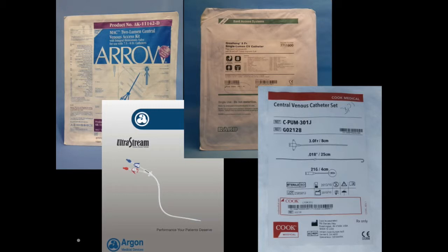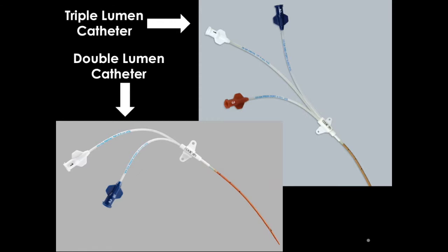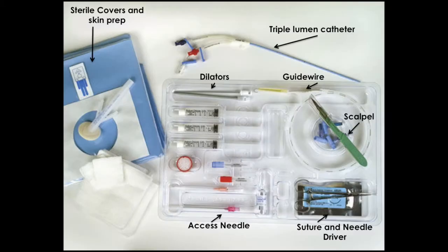There's special equipment you use to put in femoral CVLs. There are many kits that can be used. In this instance, we use the Cook brand of kits. They come in multiple sizes. The usual one to use in an infant would be either a four French or a five French kit. They come in lengths anywhere from five to 12 centimeters, but the five or eight centimeter would be more likely to use in a newborn. There are multiple pieces of equipment within the kit, and additional pieces are necessary to hook up to our central venous systems. There is a needle provided in the kit, but sometimes you might choose to use a different needle, in which case you might need a different guide wire to aid in access of the vessel.